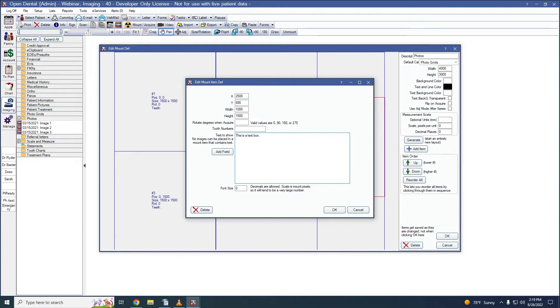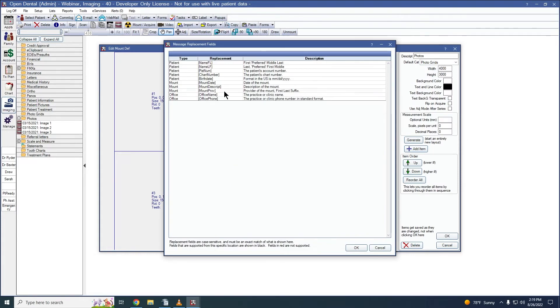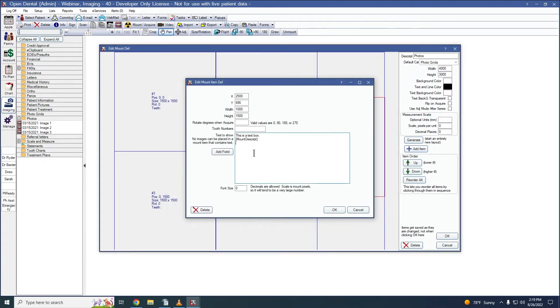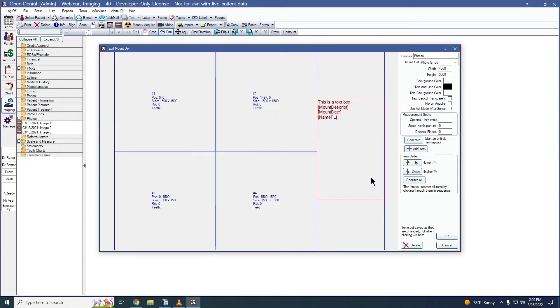Items with text in the text to show box cannot also be used to display an image — it is purely a text field. We can free-type text into this box or we can use replacement fields, which automatically fill information from our database. Let's add the description of the mount, the date of the mount, and the first and last name of our patient. Last, I can choose a font size for my text to display — this is measured in pixels, so you'll want to start with a large number; let's go with 50. Clicking OK saves our item, and I can click OK once more to save our new mount definition.